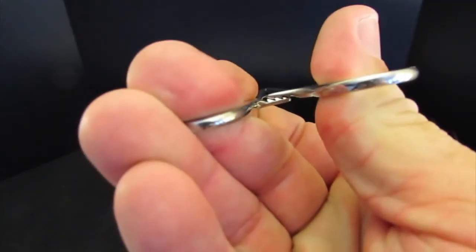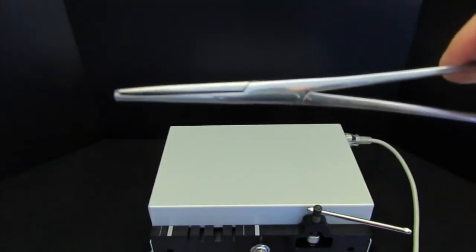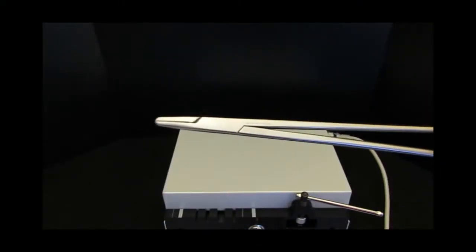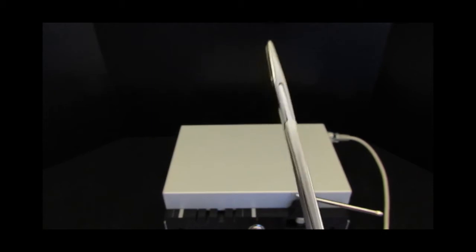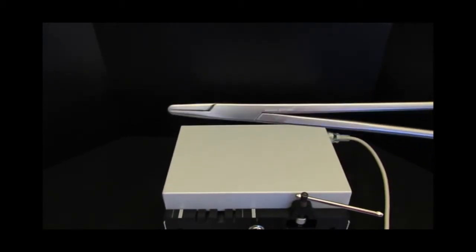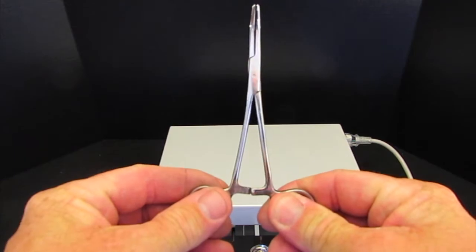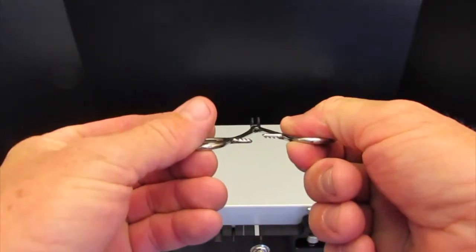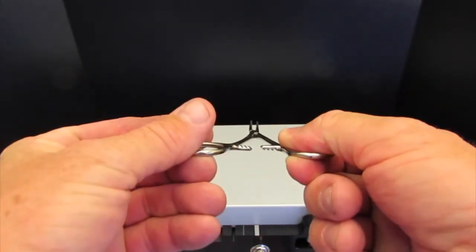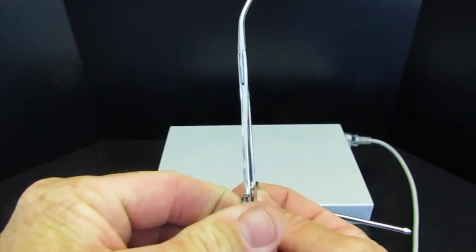Surgical instruments are exposed to extreme temperature variation due to autoclaving. This can cause a box lock to loosen due to heat-related expansion and contraction. The action of closing and opening the instrument can also loosen the box lock. A loose box lock can cause an instrument to fail during use because it does not hold the ratchets firmly together and does not allow the jaws to align properly.